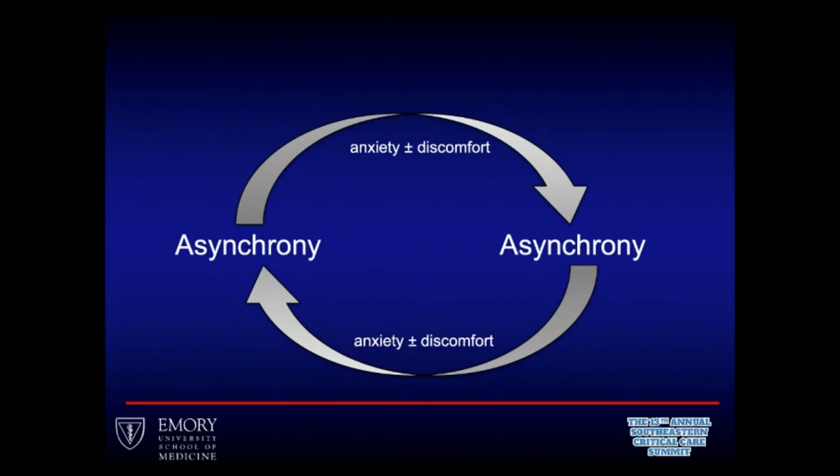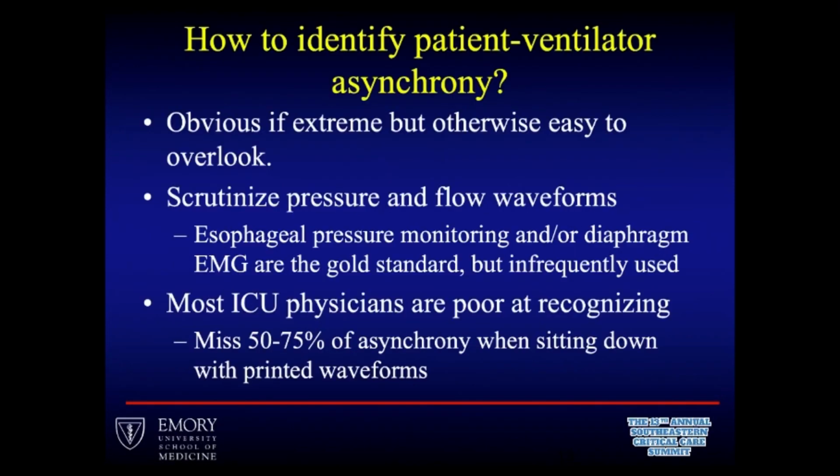So the problem is that asynchrony leads to anxiety in the patient and the person standing there watching them breathe, and that leads to probably more asynchrony if you are the patient, and hopefully less asynchrony if you're the doctor or provider that's managing it, but it can be tricky. So how do you identify that as asynchrony? Well, that 10 to 88% is probably because it's really obvious when it's extreme, but there is a lot of asynchrony that you'll miss if you don't look carefully.